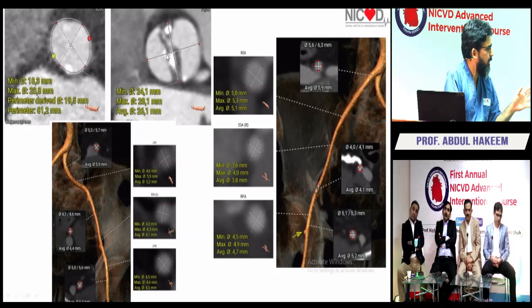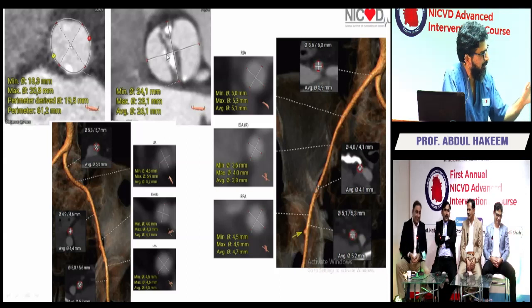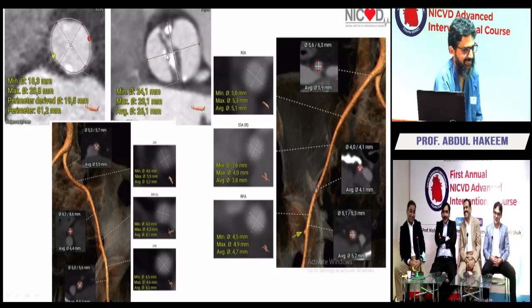So again, what did we decide about the valve size? What size would you put, Naeem? Okay. No, give me a valve size. No discussion. What valve size? I think 23 will be more than enough. Jehangir? 23. Khalid? 23 or 26. Let's do the balloon first and see how it goes.